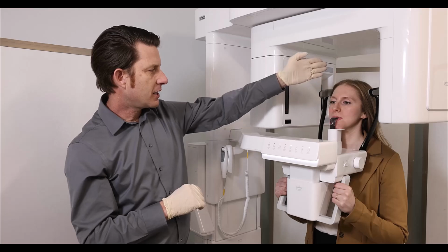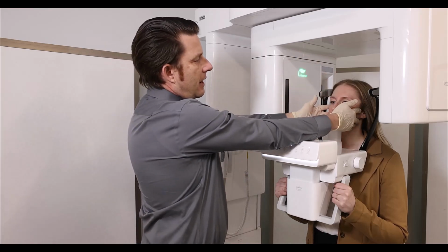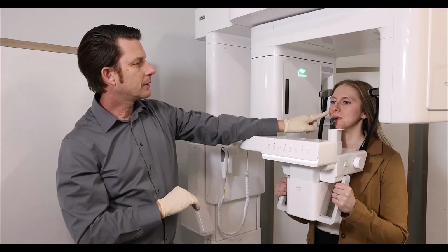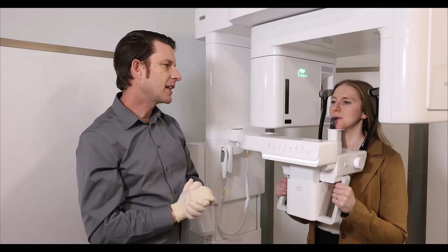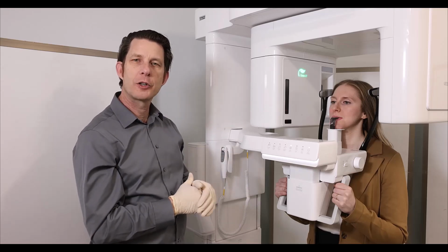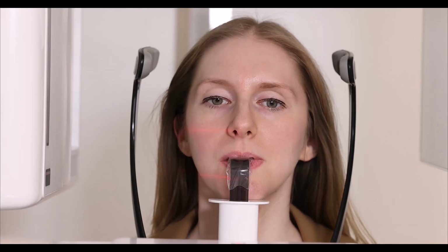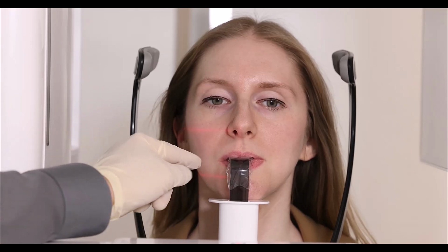Next, I'm going to make sure the patient is lined up with our mid-sagittal beam. I can always move the patient's head left or right to get that line lined up right between the eyes and right through the philtrum. You do see our top horizontal line. We want this to be right at the gum line or at the CEJ, and in this case of the maxilla, since we're capturing something in the maxilla, or we're capturing tooth number 15 in this case. If you are capturing something in the mandible, you'll want that line to be at the gum line of the mandible. So in this example, we're going to get our red horizontal line right at the CEJ of the maxilla.